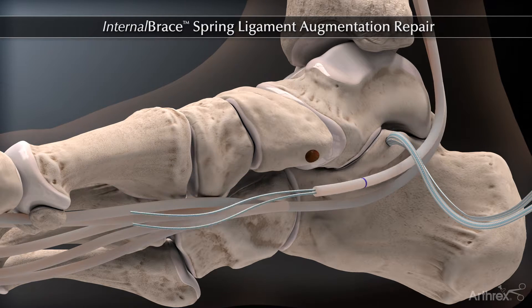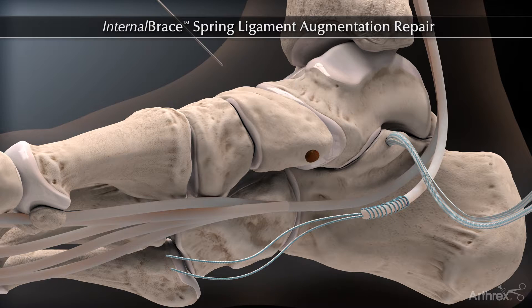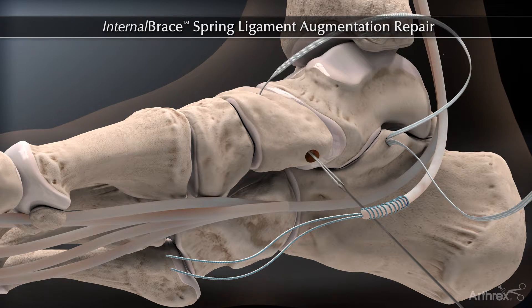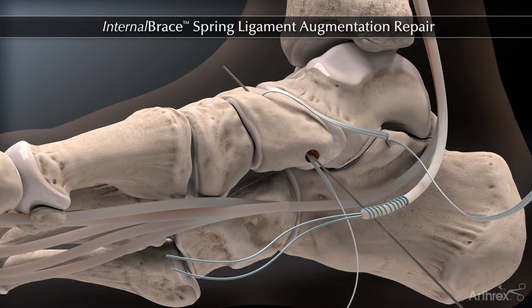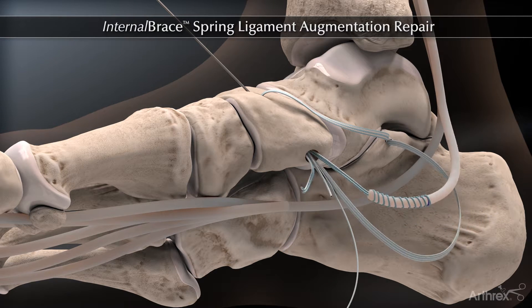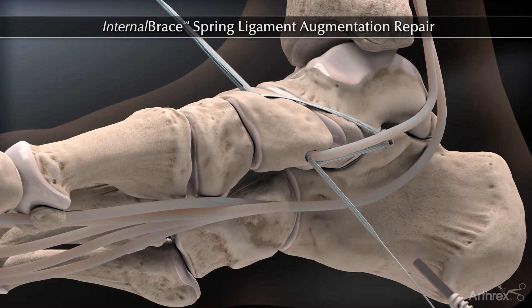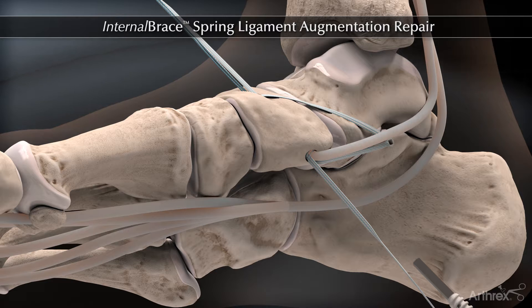Next, one limb of the fiber tape is taken and passed from dorsal to plantar, and the other limb of the fiber tape is passed from plantar to dorsal. If a flexor digitorum longus transfer is being performed, it is passed in conjunction with the second limb of fiber tape from plantar to dorsal. This recreates the hammock effect of the spring ligament, making the two ends of the fiber tape force equal in strength on the navicular.